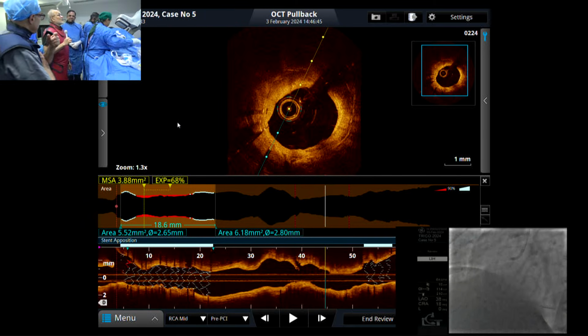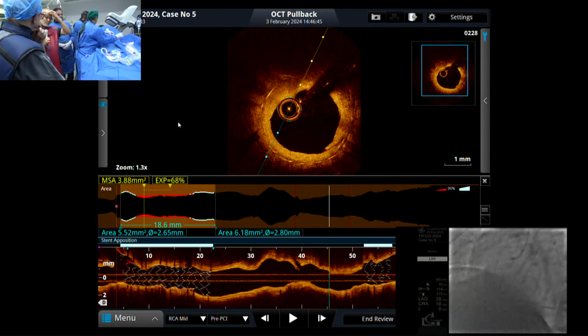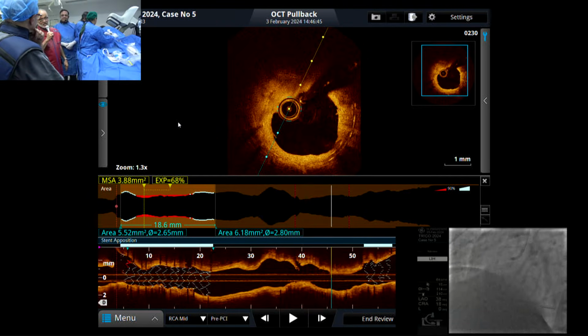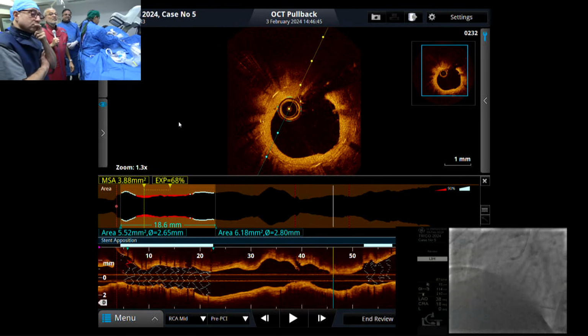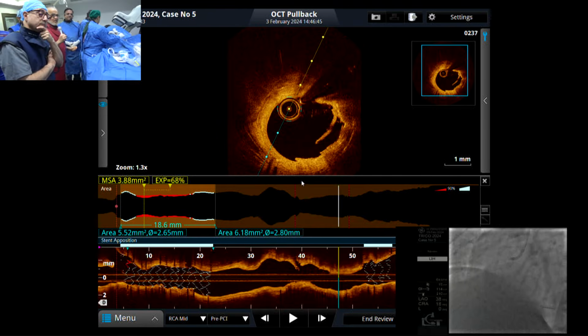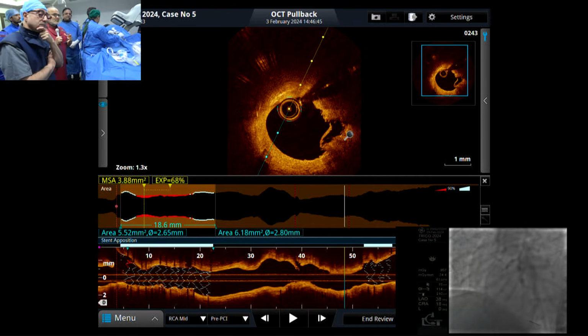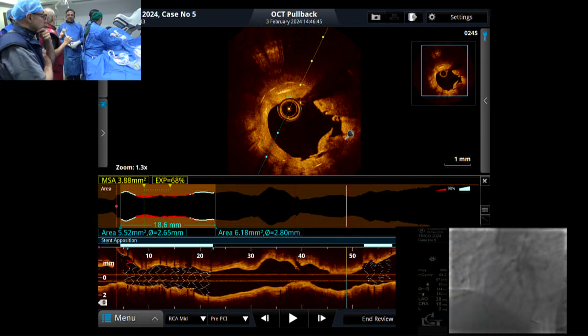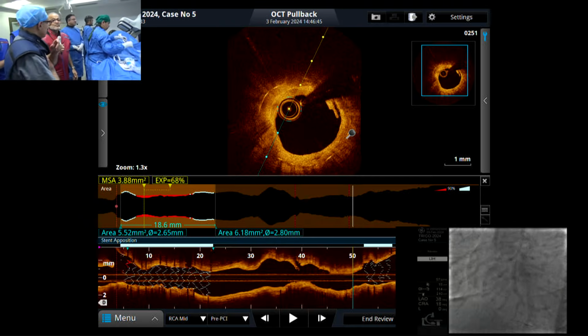This would be a good case for a brachy or a drug-coated balloon. Oh, that we don't have. Drug-eluting balloon, because we already have 2 stents. I think if it is not available, I would love to crack it with a Wolverine, just Wolverine it and leave it. Just the balloon angioplasty. The advantage is that at least it's a good size.